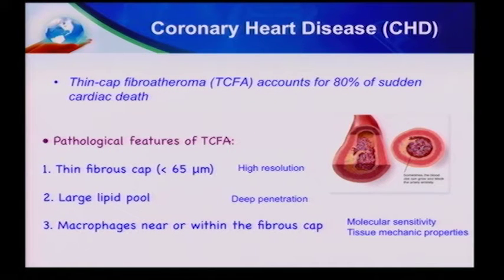So essentially, we want an imaging modality which can identify that thin cap. We want to know how deep the lipid pool is, and we want to know the composition of that plaque as well as the tissue mechanical property on the surface.